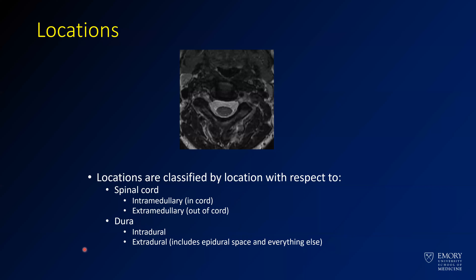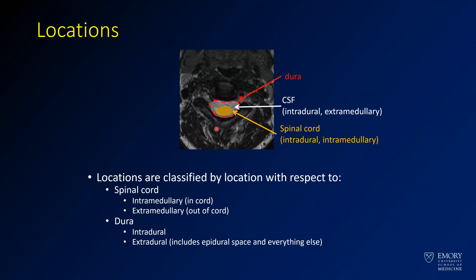When categorizing the location, you really have to decide: is it in the spinal cord, or intramedullary? Is it outside the spinal cord, or extramedullary? And then is it intradural or extradural? On this T2-weighted image of the C-spine, you can see the spinal cord. If it's in the spinal cord, the whole cord is intradural and intramedullary. Then you have the dura, the sac that outlines the CSF — that's your intradural extramedullary compartment. Everything else — the neural foramina, the bones, the posterior elements — is extradural.